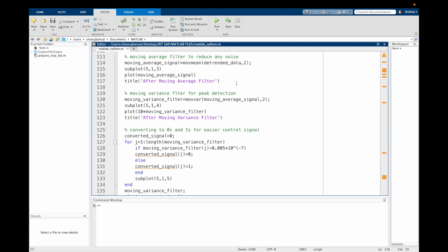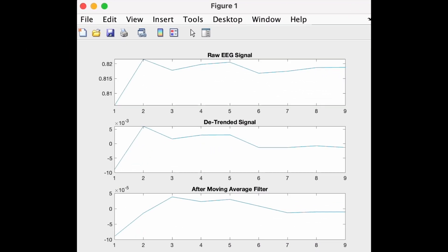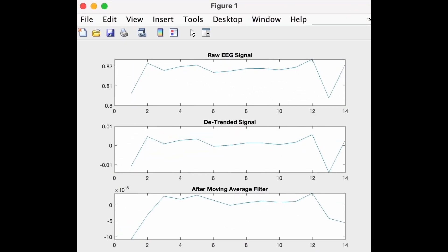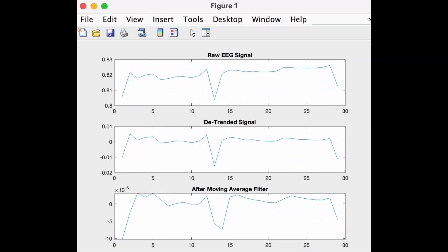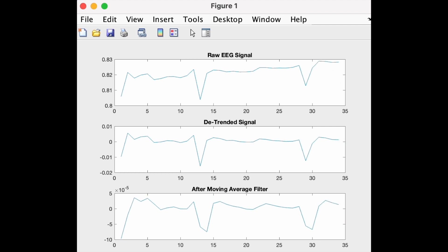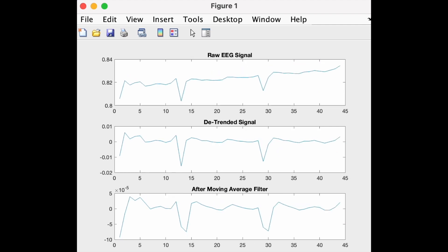Now to reduce some noise in the signal, I have used a simple MATLAB command of moving average filter, or movmean filter, which takes the average of two consecutive values to give us an output. Let's see how it looks. As we can see, the graph has smoothened a bit. But even if there was more noise, our system would not have any problem.